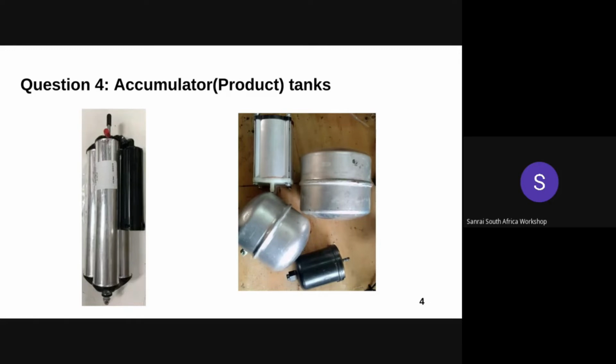So if the concentrator you are working on now is needed urgently, you can use an epoxy to join back the broken tip to the product tank. You should ensure that there are no leakages when you put the tank back into the concentrator, and that is after the epoxy has dried.